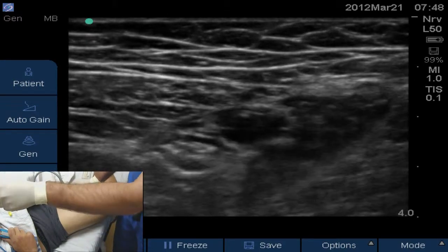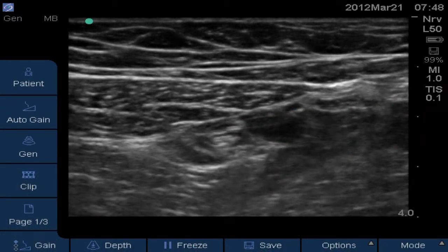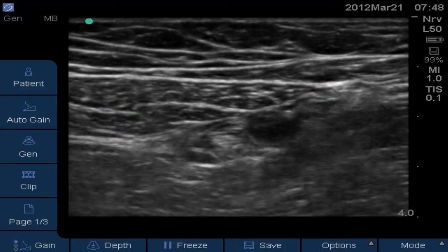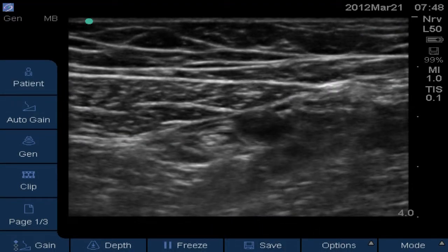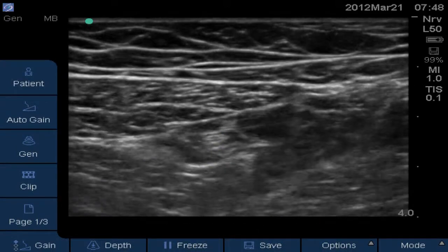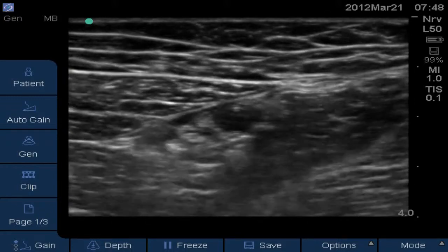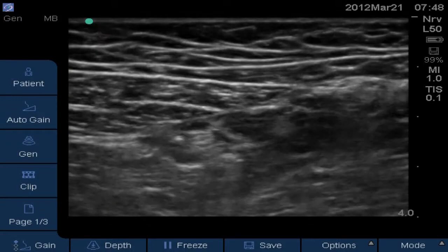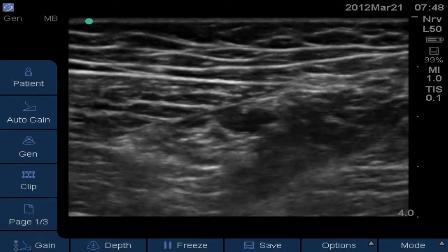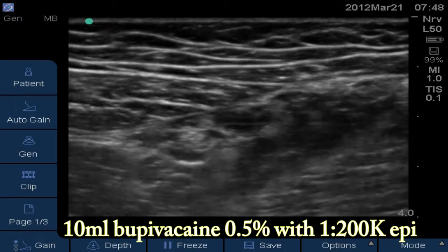We'll take the needle out. We've got our pulsatile femoral artery with the sartorius muscle just above it like a baleen whale shape, and with local anesthesia now completely encircling it, you can see the saphenous nerve at about the 8 o'clock position relative to the artery. Following up the leg you can still see it encircled with local, and following it down the leg, still encircled with local anesthesia.